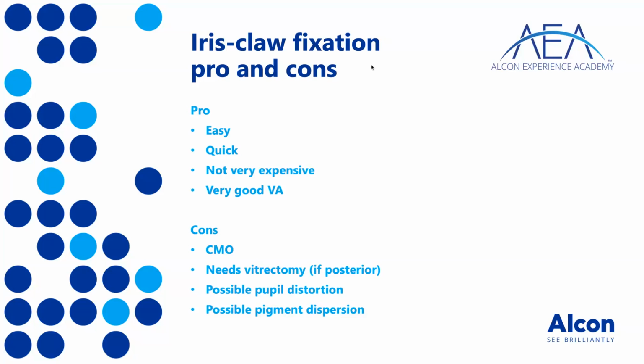The trick is that you need to know if you are going to implant the lens posteriorly or anteriorly, because there are 2 different settings on the biometry. If you use it posteriorly, the lens has to be upside down compared to when it comes out of the package.